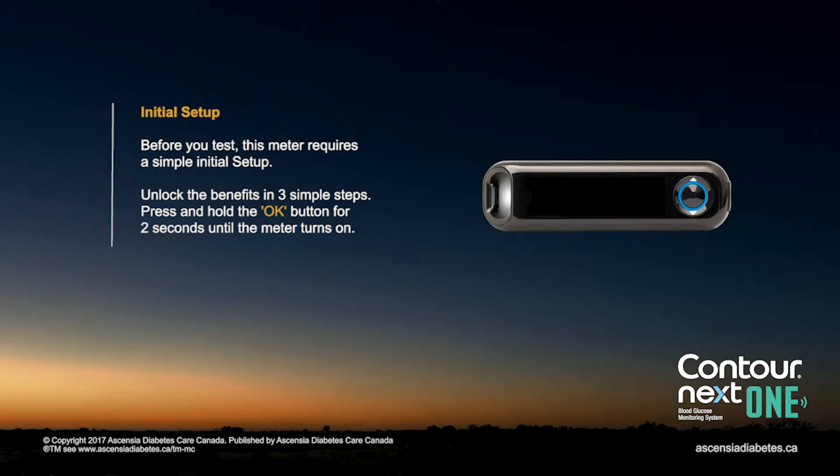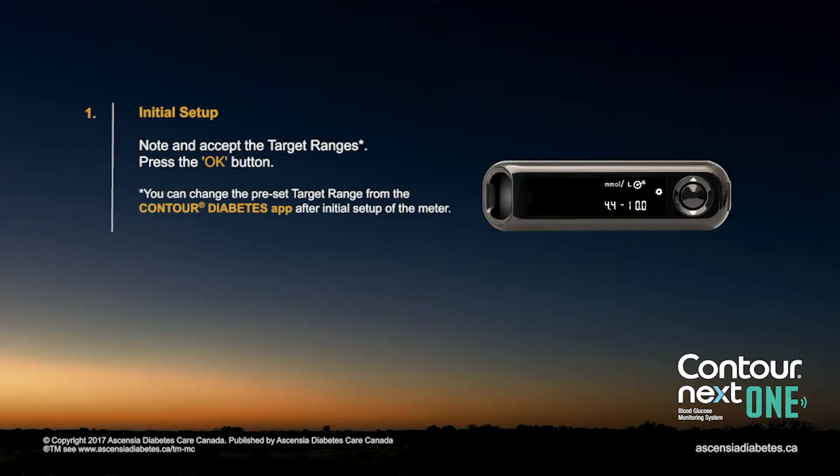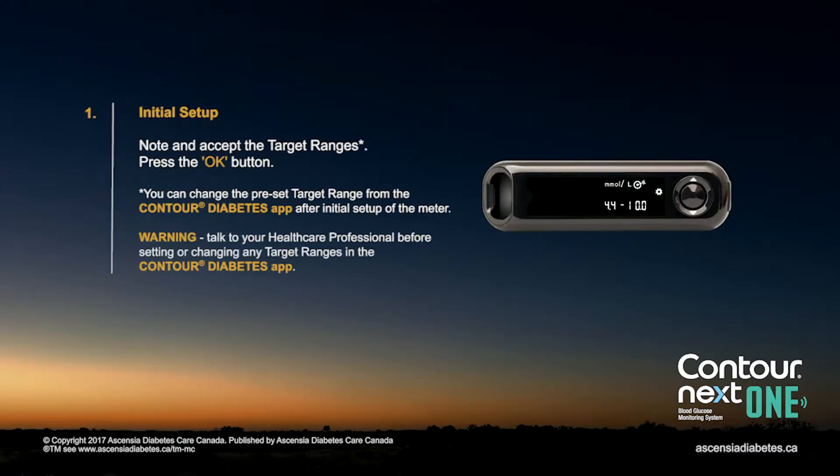Press and hold the OK button for two seconds until the meter turns on. Make note and accept the target ranges, then press the OK button. You can change the preset target range from the Contour Diabetes app after initial setup of the meter.